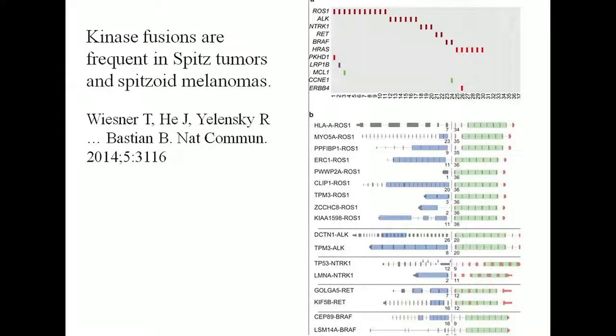I just wanted to bring up that we don't know anything about a lot of these tumors, and so look at this, spitzoid tumor. I didn't know this until I started working on this talk. Spitzoid neoplasm has all these kinase fusions, and we were just talking about, Alex was talking about how you have the same mutation in different genes, different tumor types. Here I do ALK and ROS translocation readouts for lung cancer, and here they are, all loaded up like ROS with various 5' regions being displaced, and ALK in spitzoid tumors, right? And we have a whole bunch of kinase mutations.